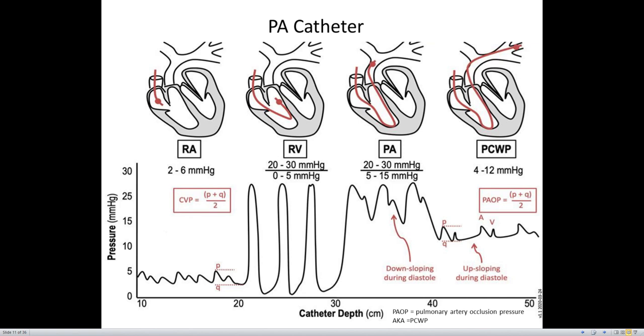You can see that pressure represented in the third group of waveforms. In this particular picture, it looks like about 27 or 28 systolic, and diastolic maybe around 16 millimeters of mercury.